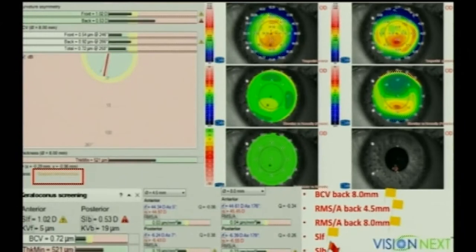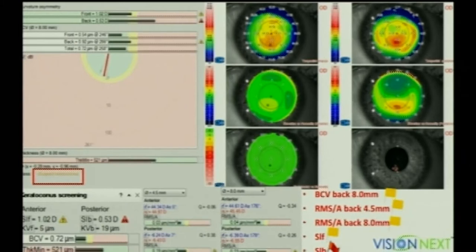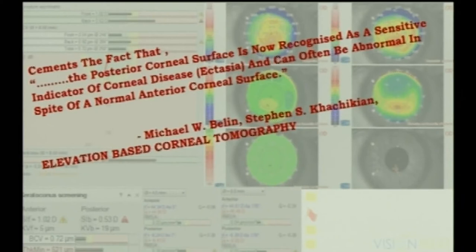Every Scheimpflug device gives different indices. Most work well for frank keratoconus but are not so great for screening subclinical cases. In one index, six parameters are checked — including anterior elevation and pachymetry differences compared to normative data. Out of 11 parameters, almost five are abnormal — hence a 'suspect keratoconus' designation. You should keep this in mind before planning any surgery for such a patient.